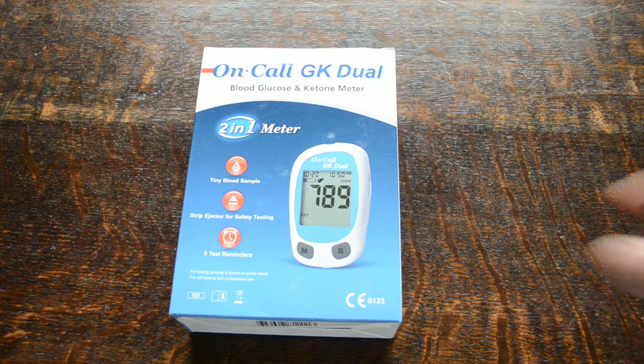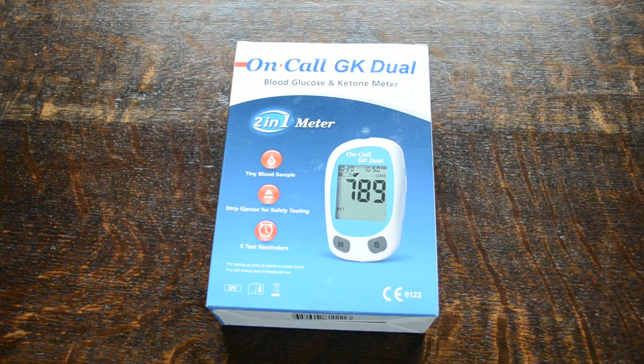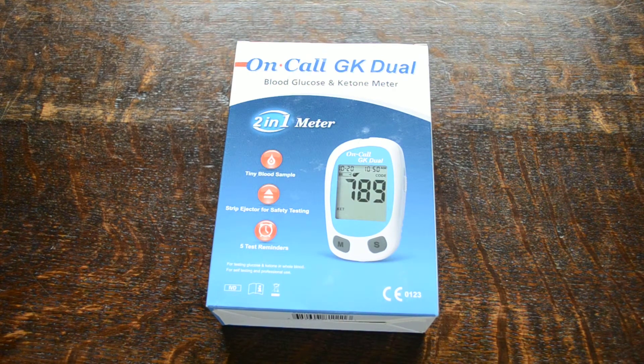The starter pack shown here is what you get when you order the initial pack. We sell this for just under 30 pounds and you get the clinical meter — this unit shown here — the batteries, control solution, and all the functional advice on how to use the meter. The starter pack does not include any On-Call ketone test strips or On-Call glucose test strips, a lancing device, or lancets — just the digital meter and control solution.